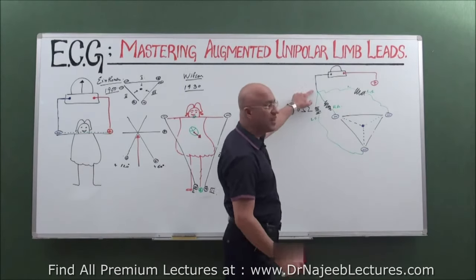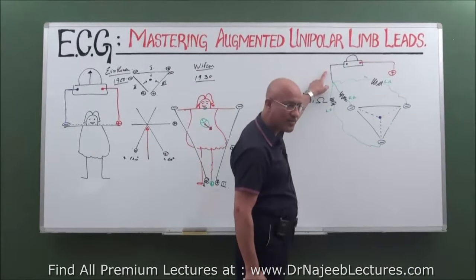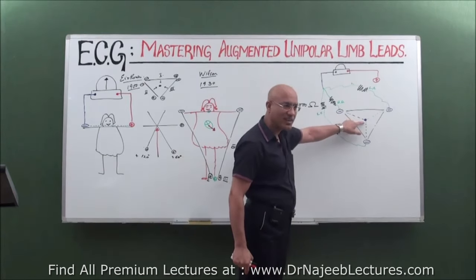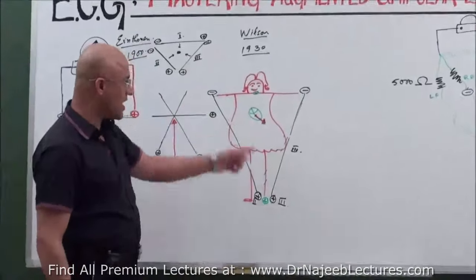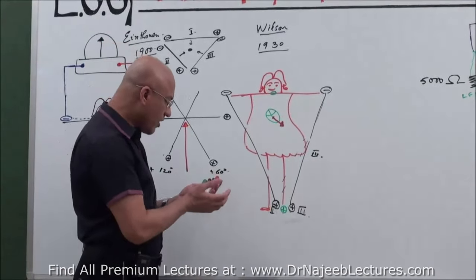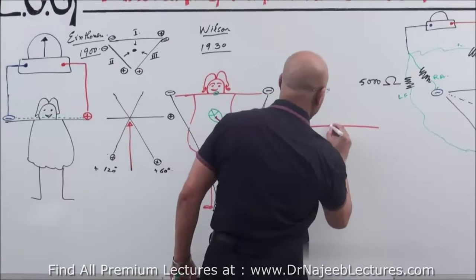So this is how the common indifferent terminal was designed and constructed by Mr. Wilson and his friends. So now you know how we achieve it. You don't need to put the electrode inside the heart, do you? Is it right? Yes. So come back to Mr. Wilson, who very much wanted to look at the bottom. So what did he do? Now I'm going to construct another lead here.